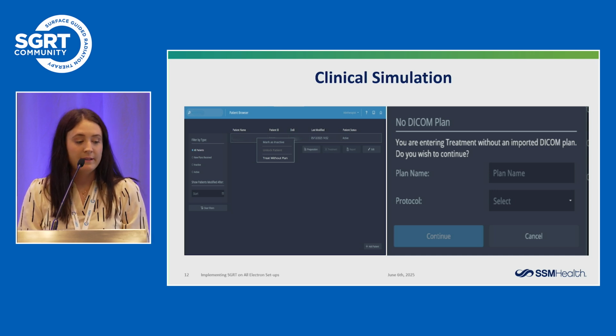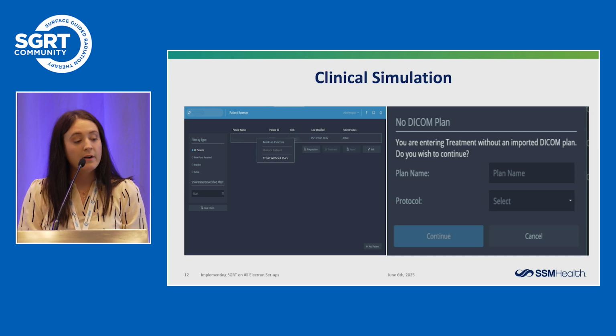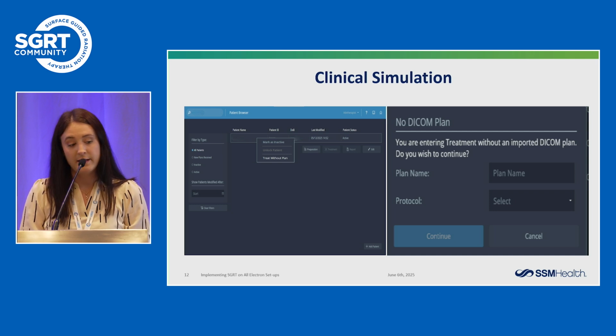So we're going to type in plan name. For sake of consistency, the plan name that we type in is the exact same plan name that we put in on TrueBeam. And that protocol you select is whatever you're going to be treating. So if you're treating something in that face area, probably going to want head and neck. Treating something on the arm or leg, most likely you're going to choose extremity.